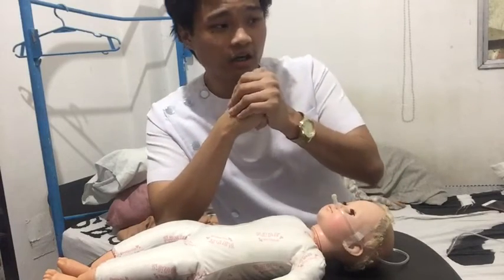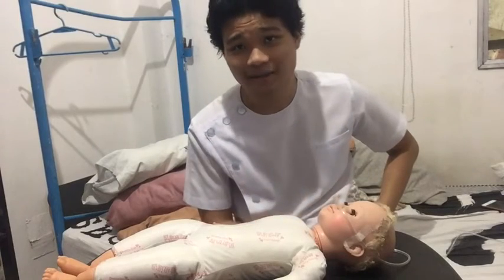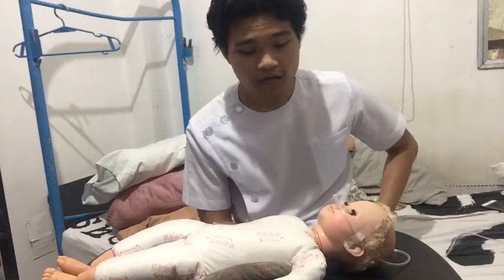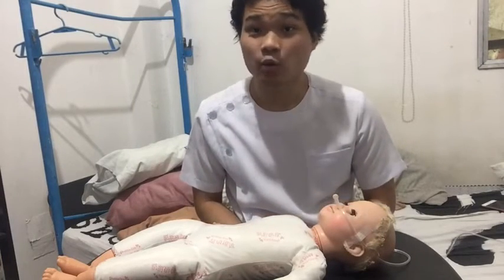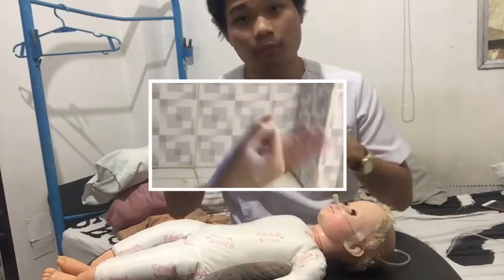And after that, we're going to have to stay with the client unless it's okay to leave. And from there, on the client's door, we're usually going to be putting an oxygen in use sign, so the healthcare team would be aware of what the client is going through. After that, we're going to be performing proper hand hygiene.